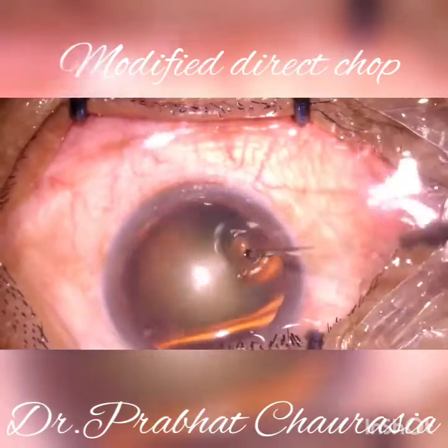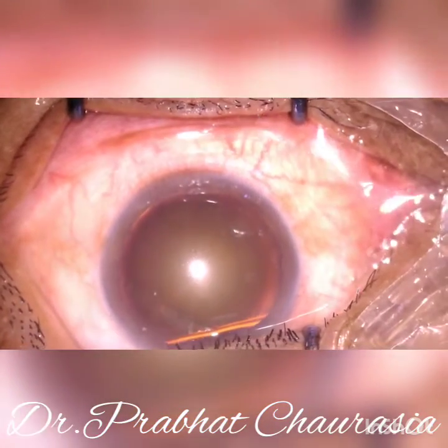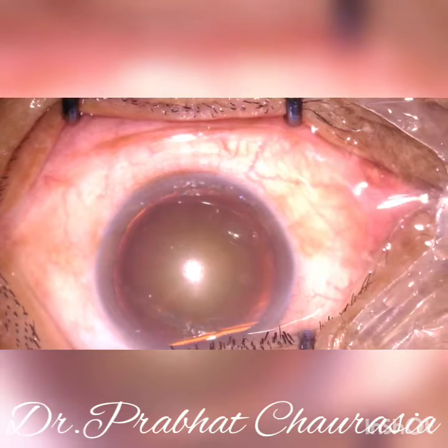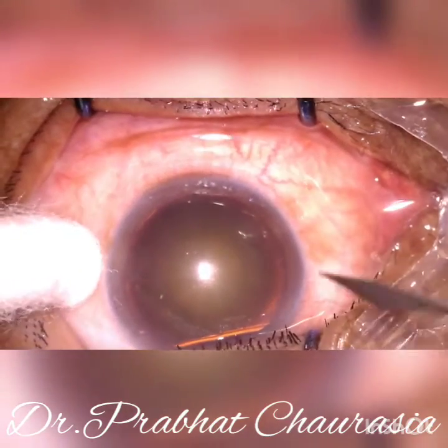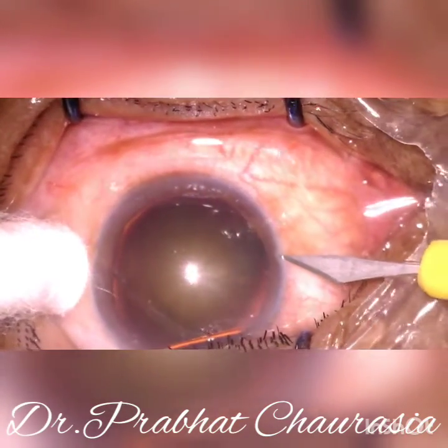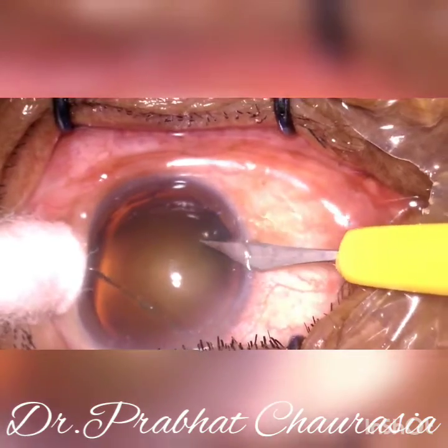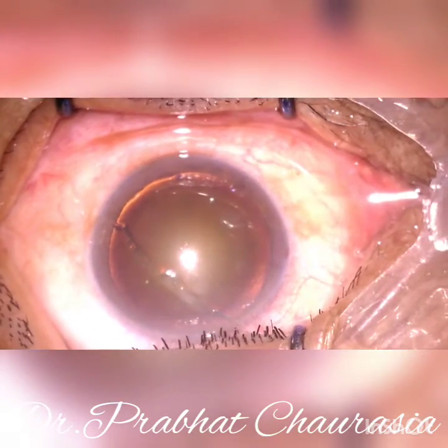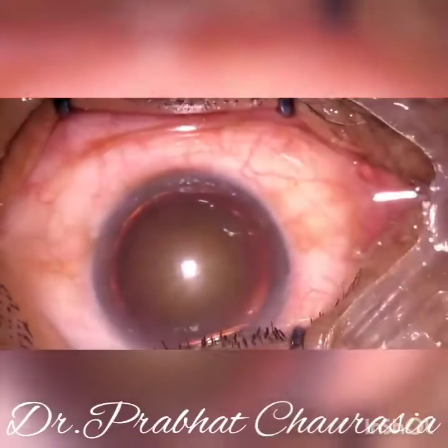In this video, you will see phacoemulsification under topical anesthesia of a grade four nucleus in a cataract patient.